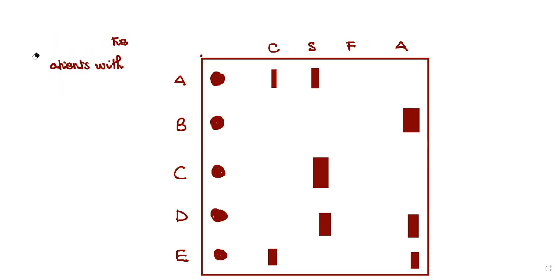Okay, it seems I went too far. Let's start. What is the genotype of the patient whose blood was put at point A? HBSC, isn't it? Because you find the band in S, sorry, in C and in S. Do you get it? Yes, Doc. What is the genotype of patient B? HBAA, isn't it? Yes, Doc.